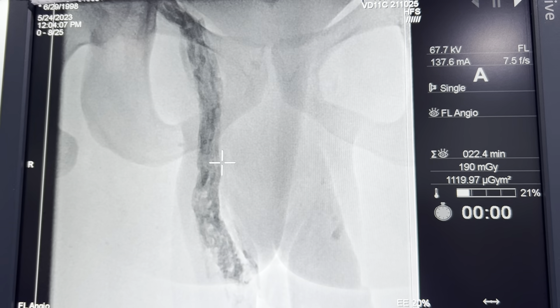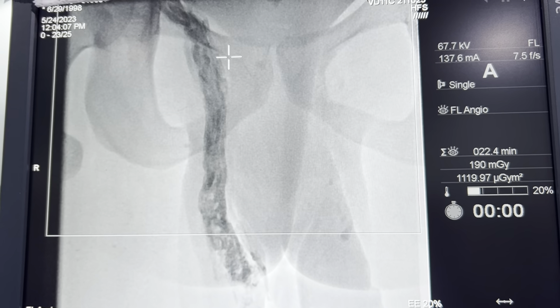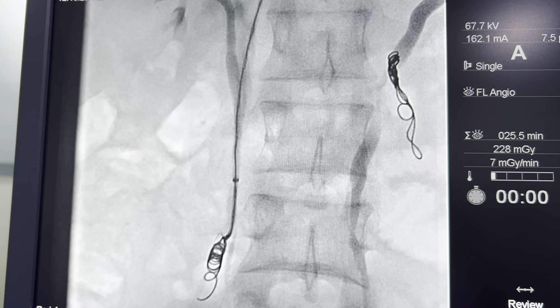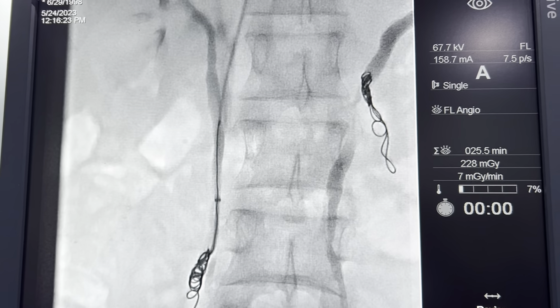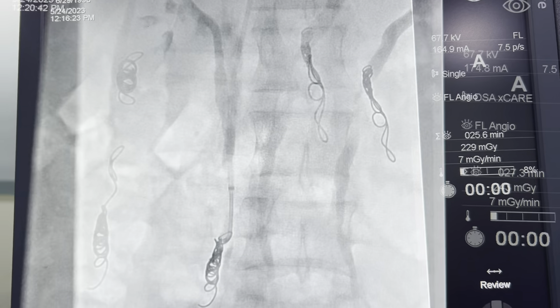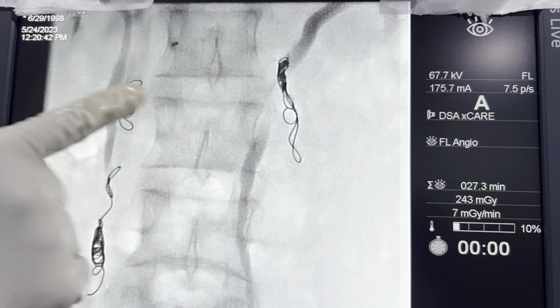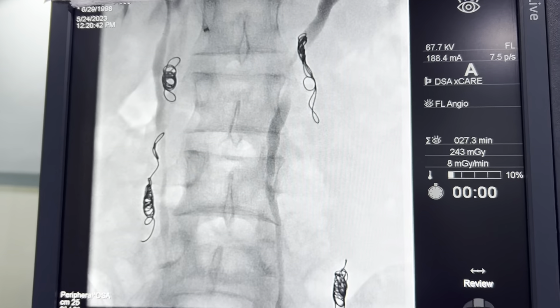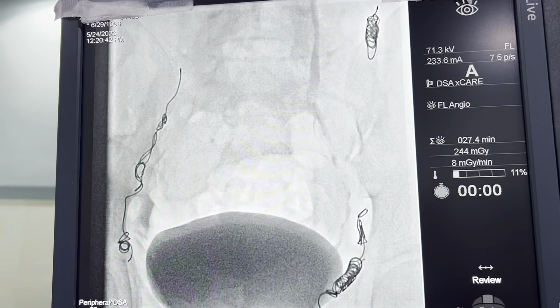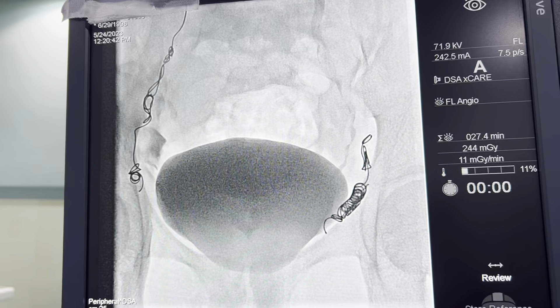We're going to go to the gonadal vein again and then start our treatment. Right side — deploying the coils on the right side. You can see that's the nylon coil coming out of the catheter over there, and now it's fully deployed. You can now see the coils on both sides, the left side and the right side, and we're completely done with the procedure.